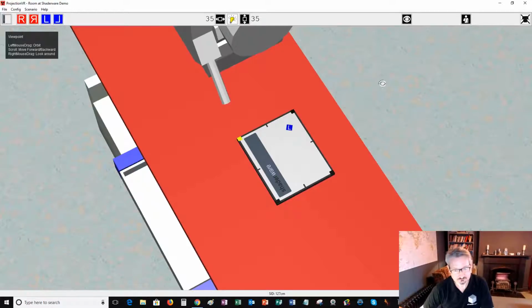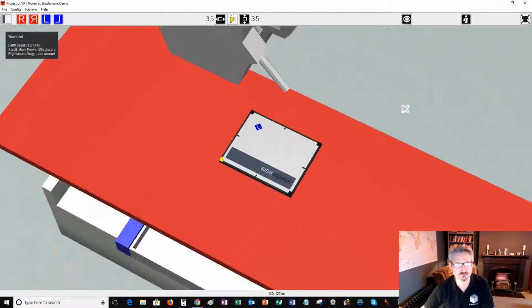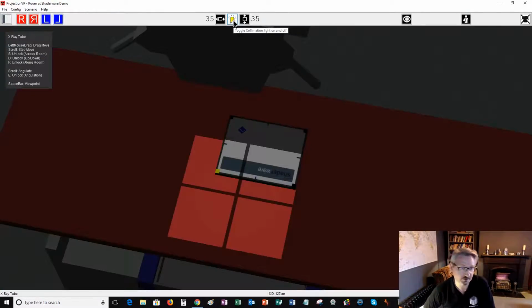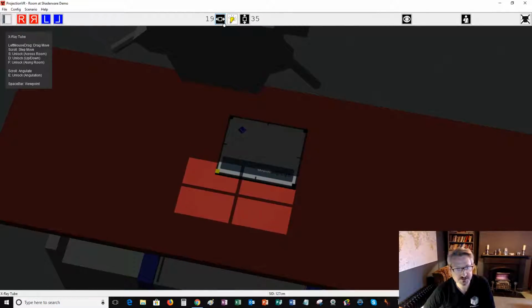Okay, now we want to be able to collimate. So these buttons here on the tool ribbon are equivalent to pressing the buttons on the light beam diaphragm. So if I press the light button on, then I get my collimation. And if I hover over the left-hand toggle here and use the scroll wheel, then I can change the size of the collimation.